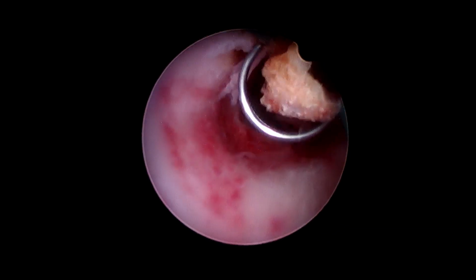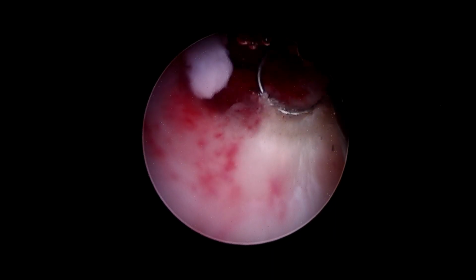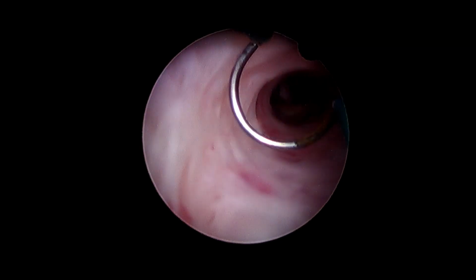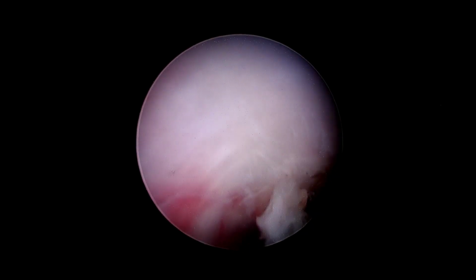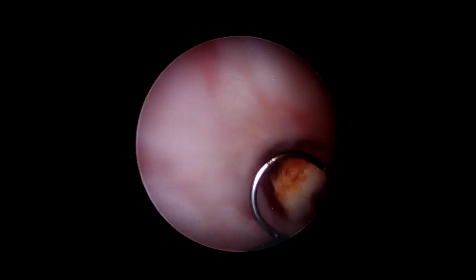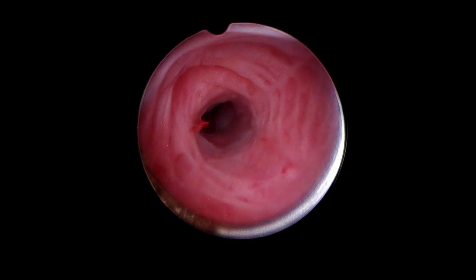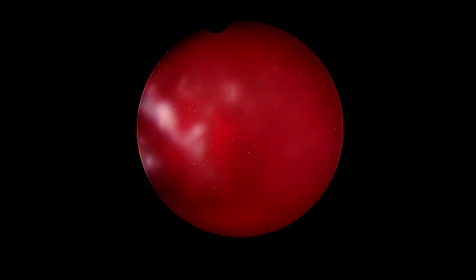There was a scar also present at the level of the internal os. You can notice these white fibers, and I'm going to excise even that. I don't want any scar inside, so that I can maximize the fertility preserving procedure that I am doing, and maximize the result for this particular patient. So that's it. We have excised the scar also and incised the Asherman's syndrome. You have to be very careful and quick to prevent complications in this syndromic disease of the uterus.